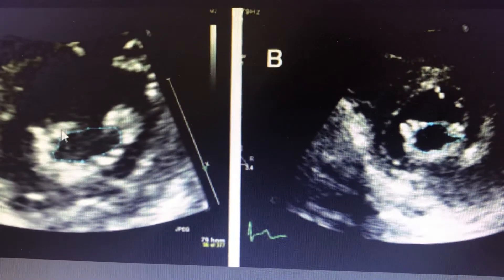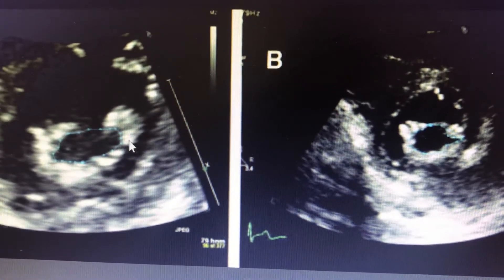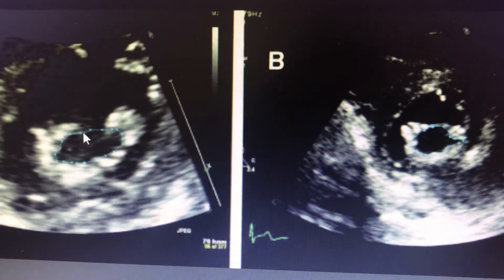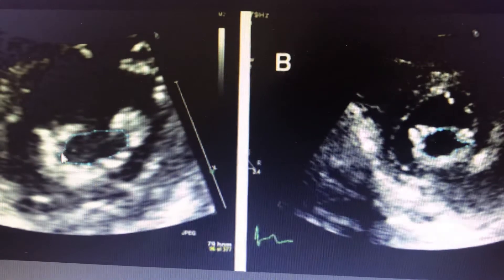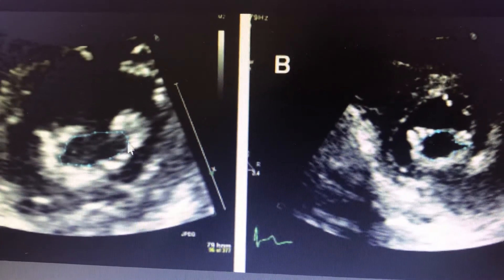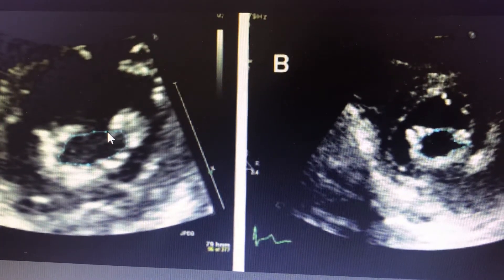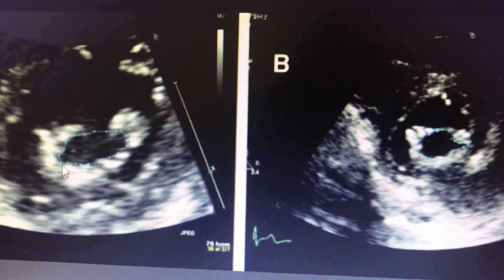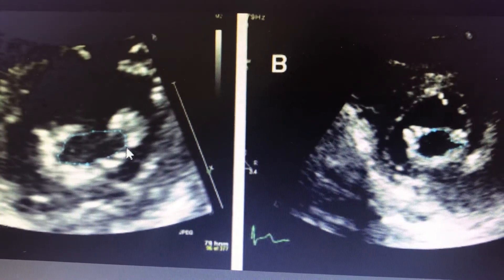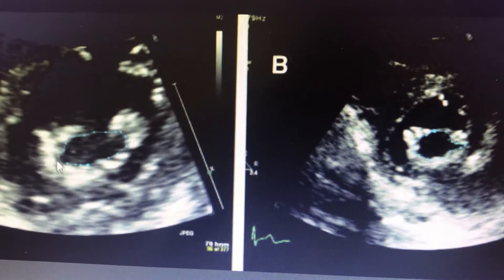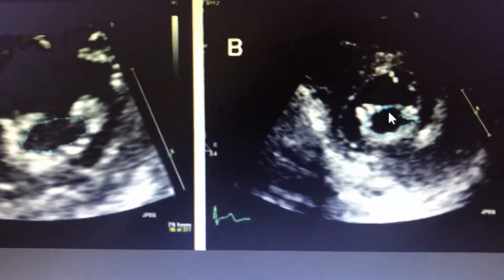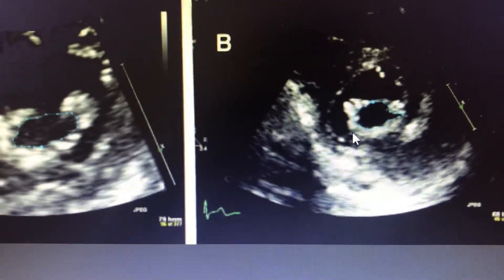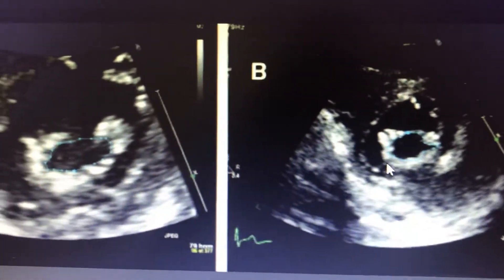This is the planimetric measurement of the area of mitral stenosis. In diastole, you measure the planimetric area — you put lines to cover the opening, and it will give you the mitral valve area. This is the measurement of the planimetric.